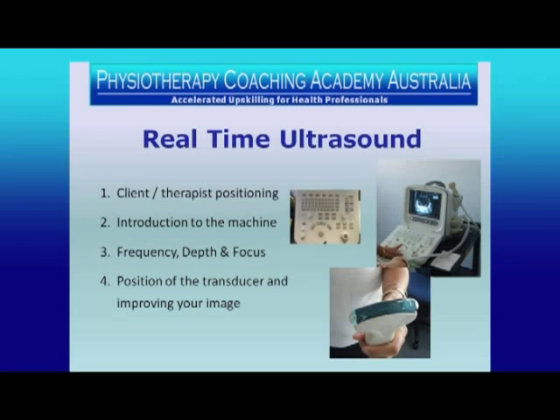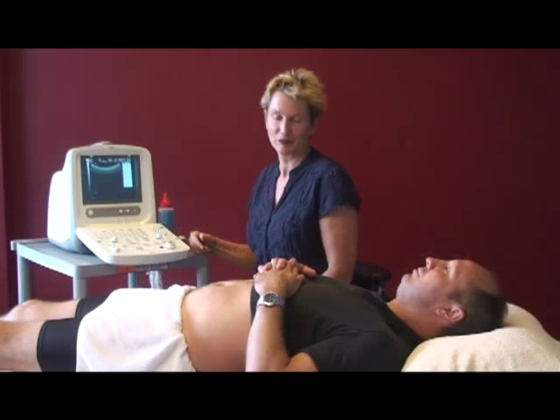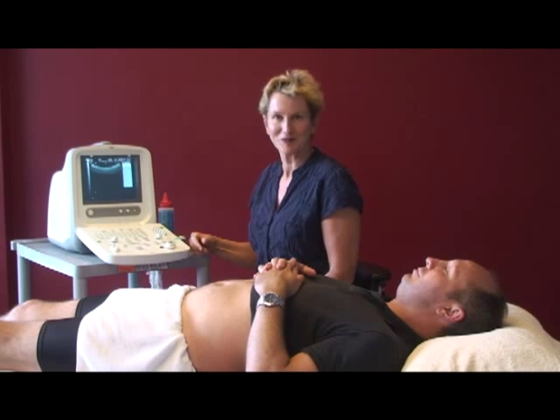The next one will look more closely at the panel and the key features that we should be looking at, including depth, focus and frequency. And the last thing we'll look at is how you can improve your image. Okay, let's start with the first one.